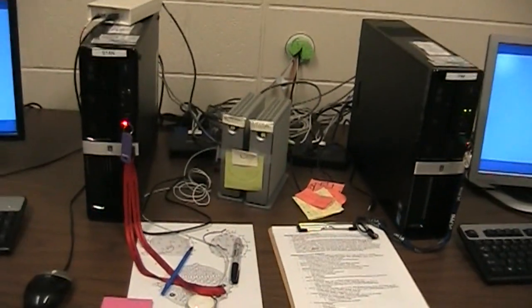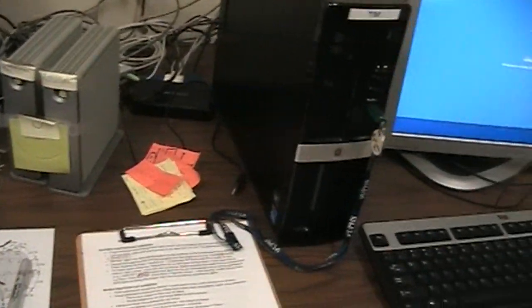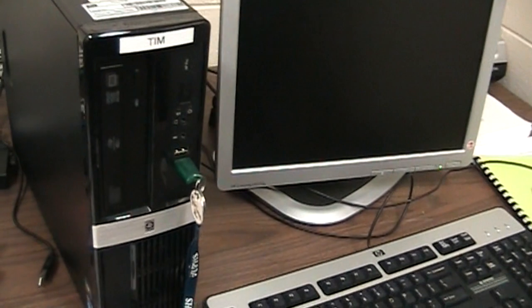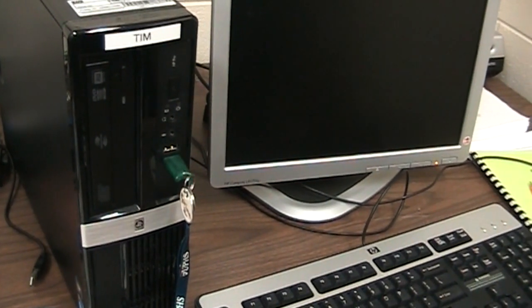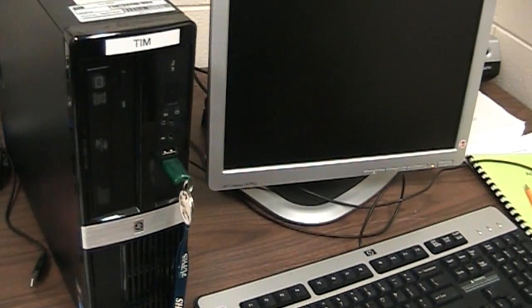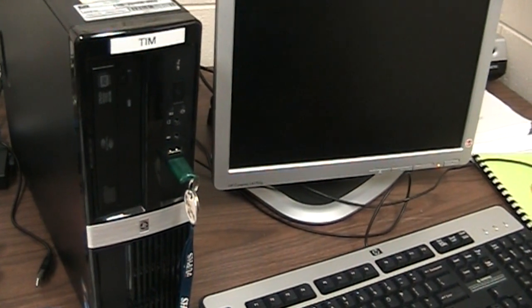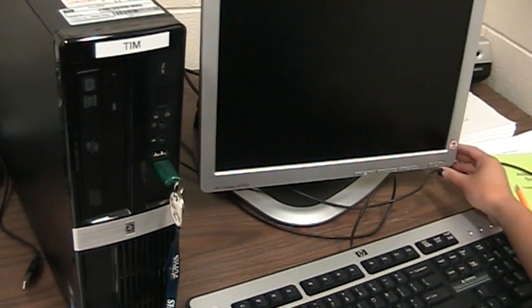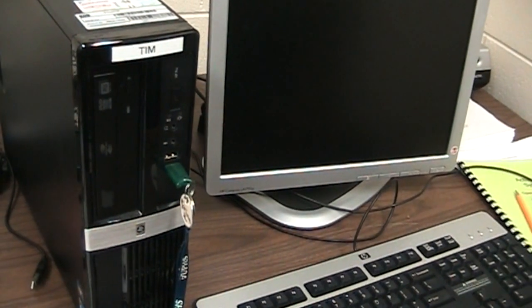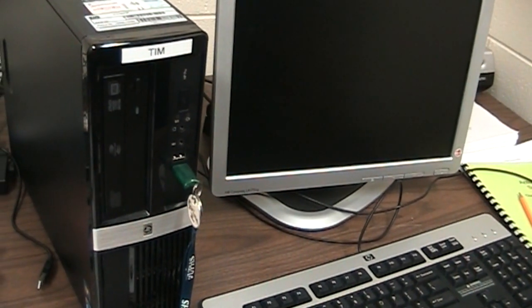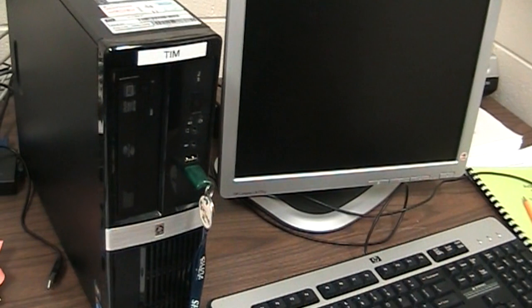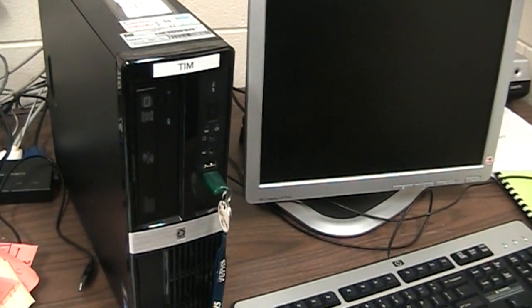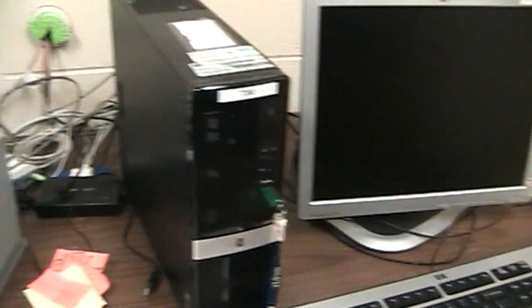And while I have this on, I want to point to the two USB connectors with the E-Prime computer. The green USB special device allows editing of an E-Prime program. You can run the E-Prime program without the device. But if you need to change it or edit it or create a new one, you need that in the computer in which the editing is going on.